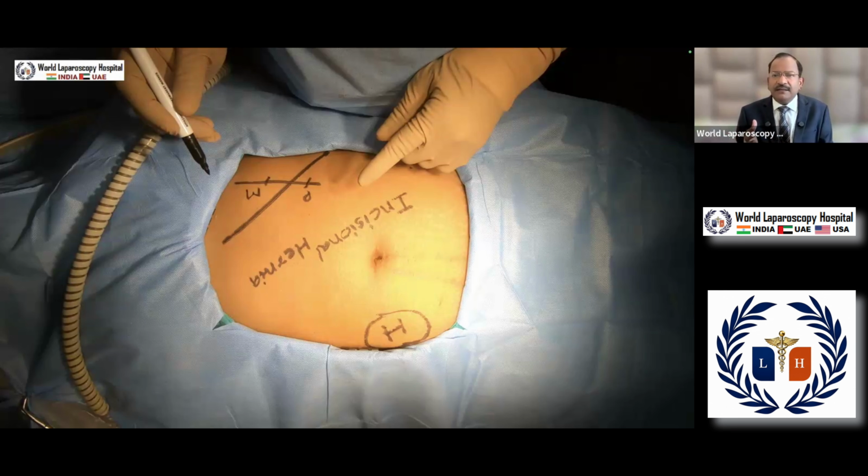And the third advantage, once surgery is over and you remove the gas, again it goes anterior to the rib. So, you do not need port closure, because hernia will never happen, because the rib will not allow any bowel or anything to push through. So, no chances of incisional hernia, no need of port closure.